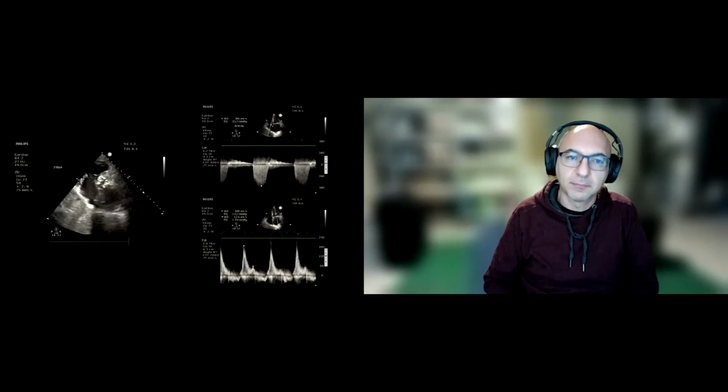So this is all in a spontaneously breathing patient who has a small oxygen requirement. They're on 2 liters nasal cannula. There's nothing fancy about that right now. Let's intubate this patient. How does that affect the parameters that we're seeing physiologically, and what are we going to do potentially differently in our management with diuretics, afterload reduction, pressors? Let's intubate this patient. We're going to convert them from a negative intrathoracic pressure to a positive intrathoracic pressure and totally screw up all these measurements. What do we do with that?